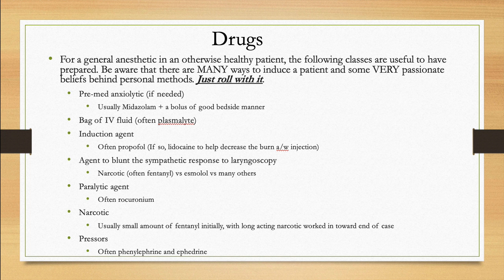Okay, the D in MSMAID stands for drugs. Now, I'm just going to offer a few comments on a general anesthetic in an otherwise healthy patient who's going to get an ET tube. The following classes can be useful to have.